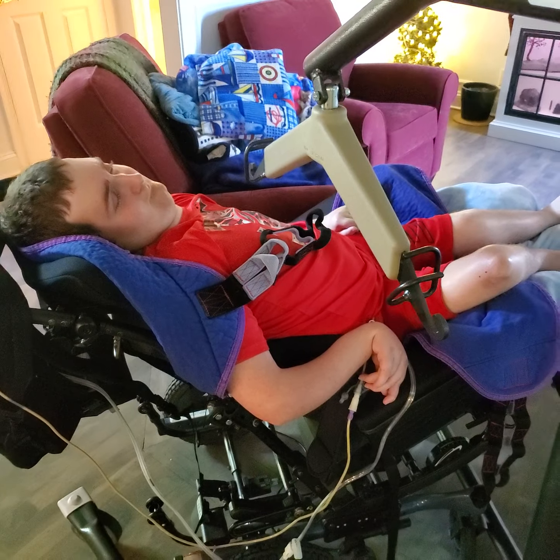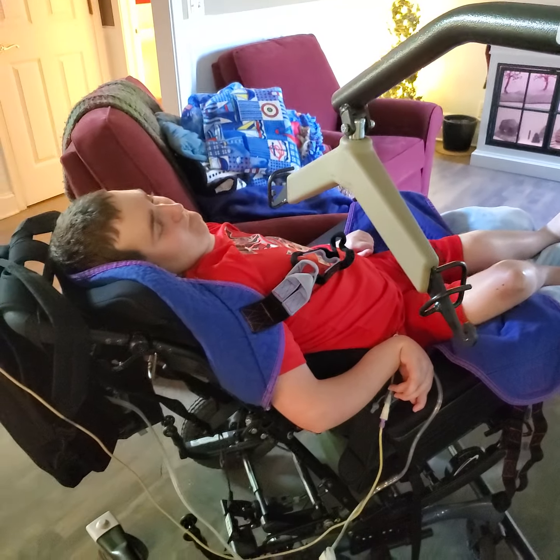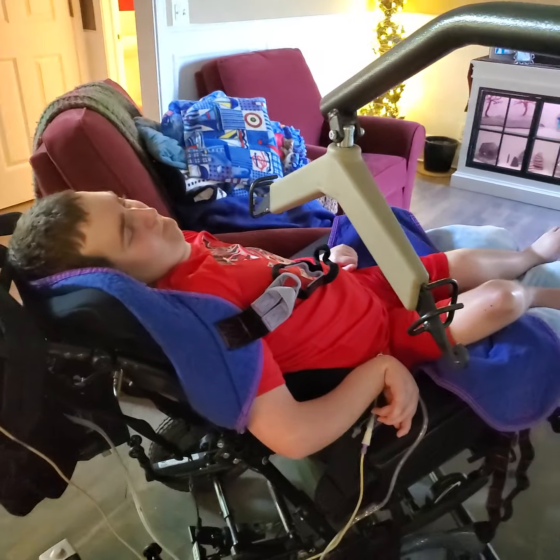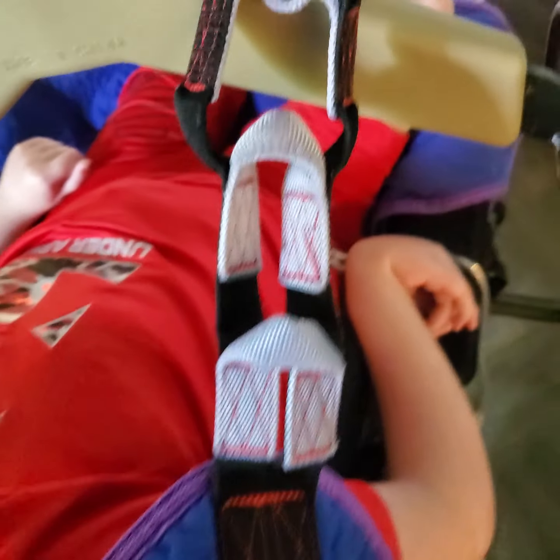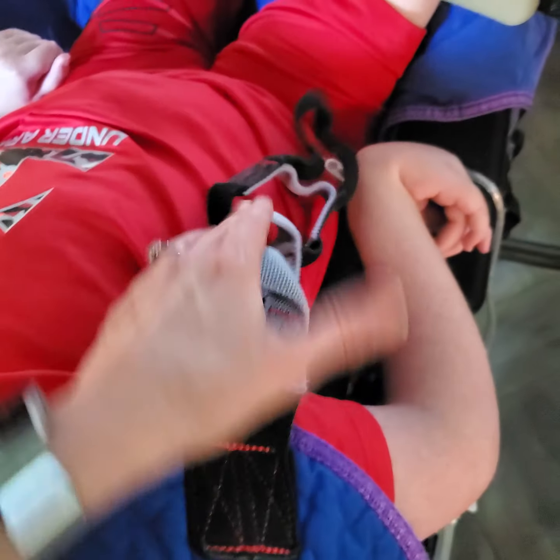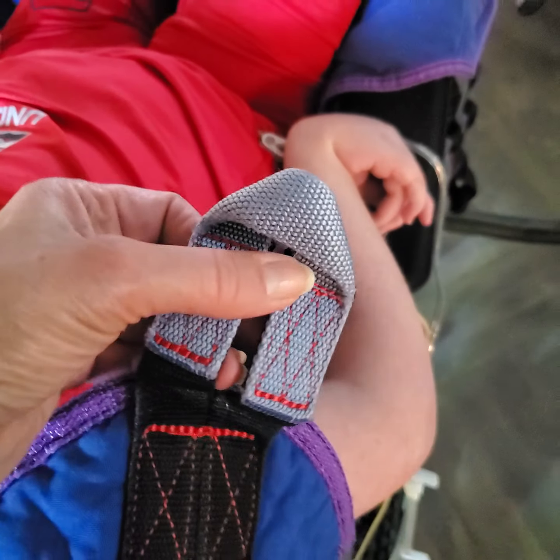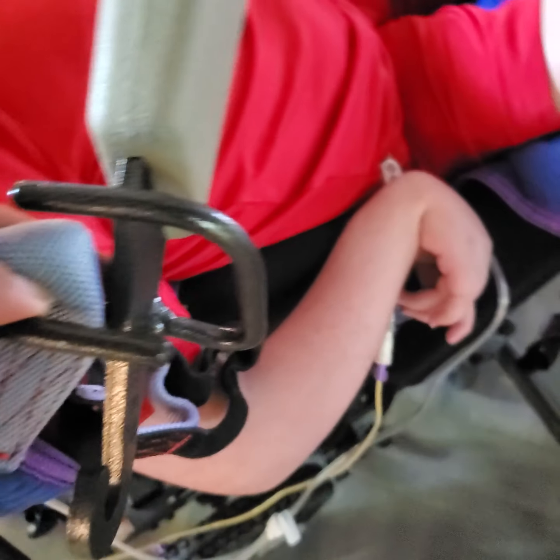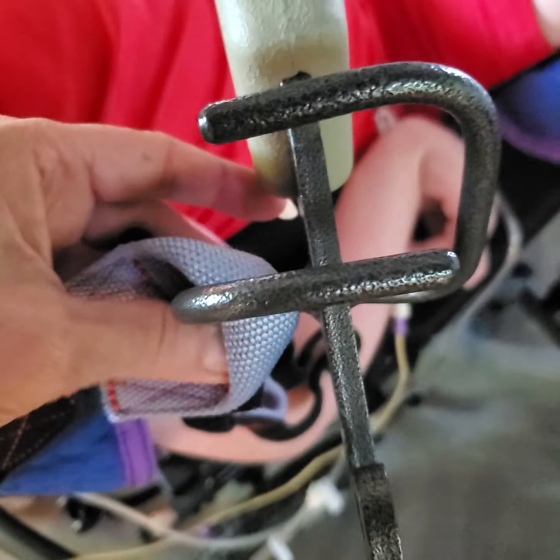Okay, so we're going to go through how to hook Jack's sling up to his Hoyer lift. You can see that he is in a sling here. The first thing you're going to do is look at the three loops here: 1, 2, 3. The lowest loop, the one that is closest to the actual sling, we're going to take and put in the first loop that's facing away from him.